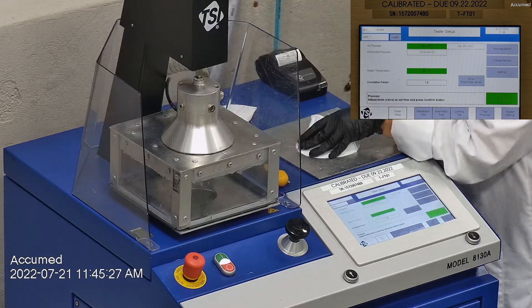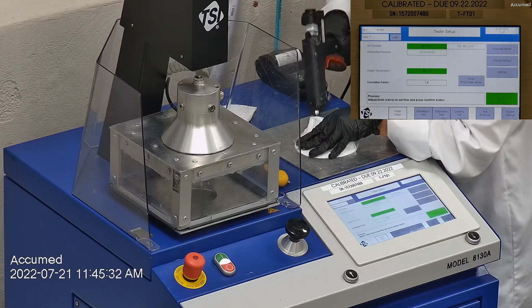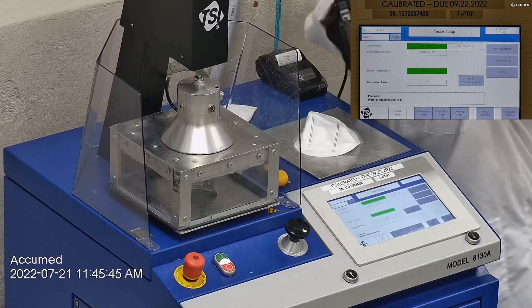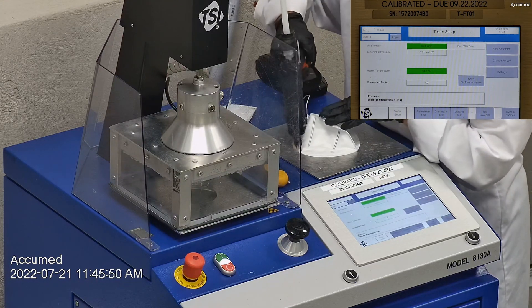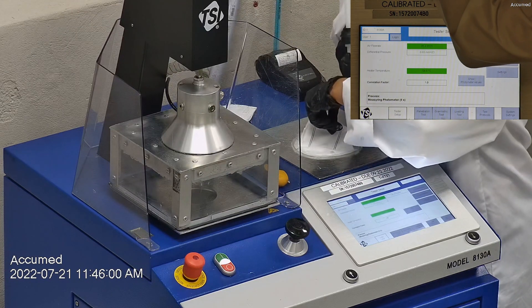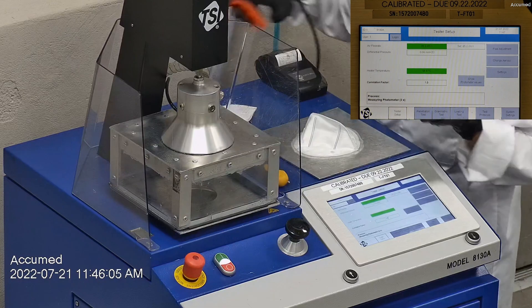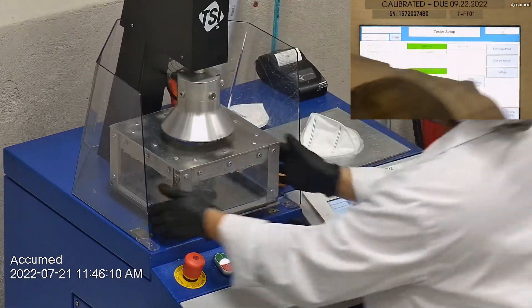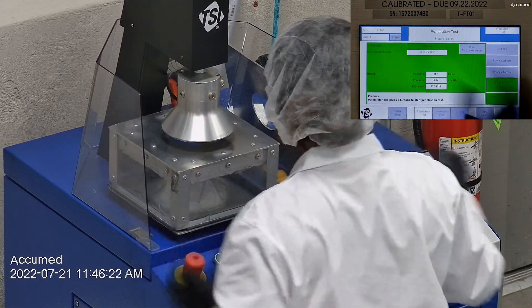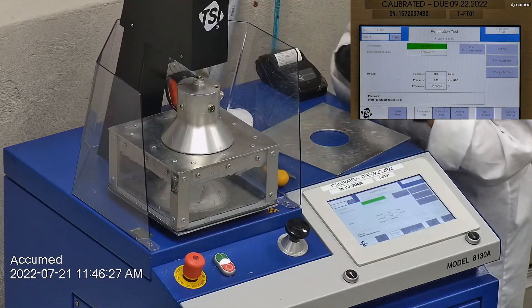The testing plate is attached to the frame and the box is placed under the TSI filter holder for testing. The results are displayed on the TSI monitor. F stands for airflow rate, which we test at 85 liters per minute. R is for resistance, also referred to as pressure drop — this correlates with breathability, so the lower the number the more comfortable and breathable the mask is. E stands for filtration efficiency percentage.